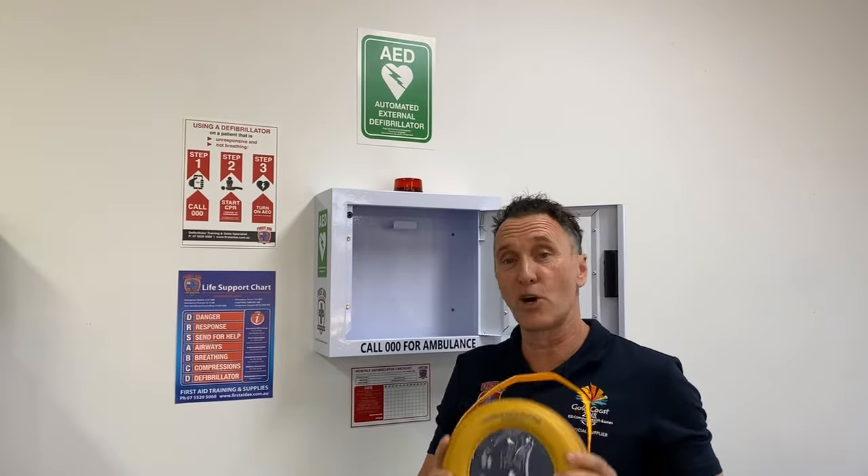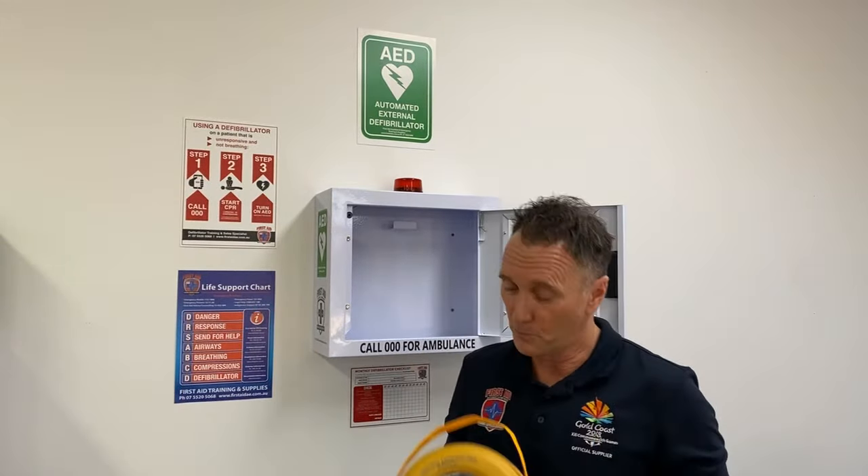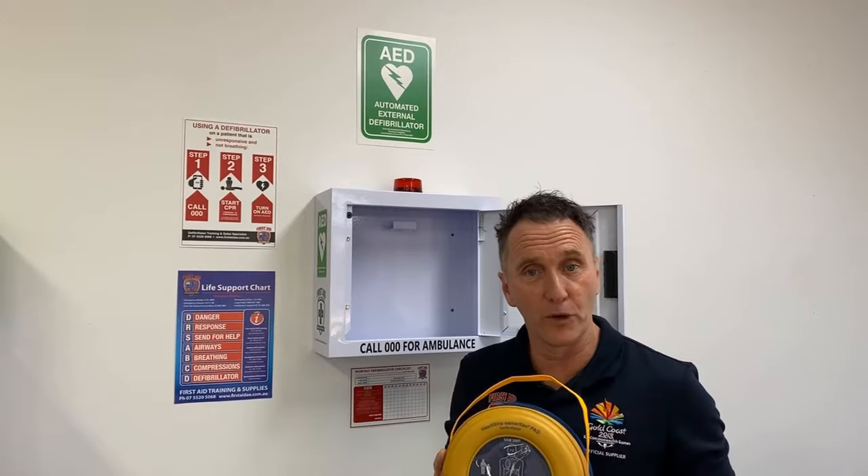The defib itself is very tough with an IP56 rating, which means it's drop proof, dust proof, and pretty much cold and heat proof as well, making it a great addition for your workplace.